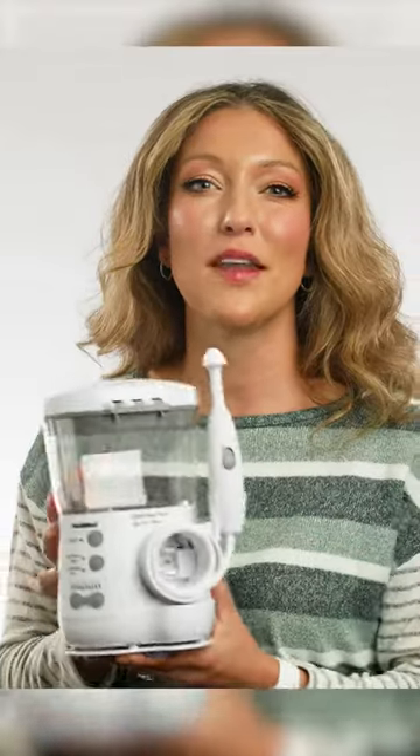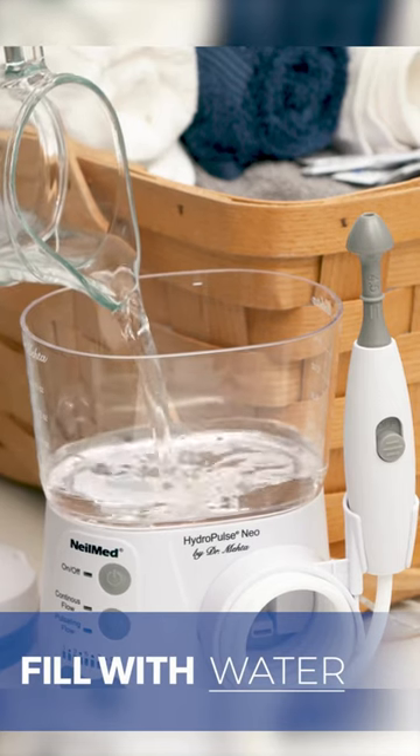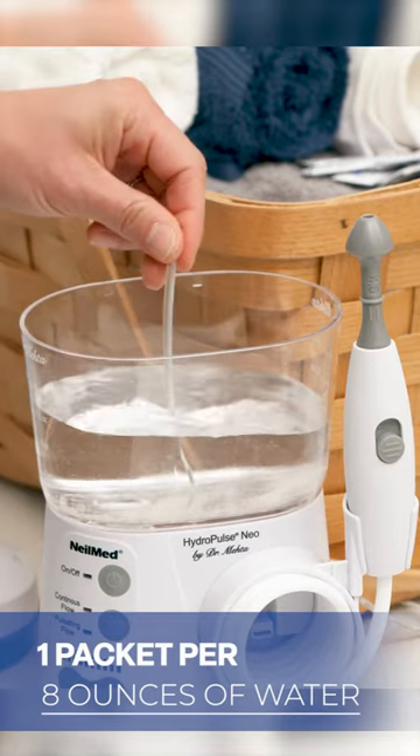To use the NealMed HydroPulse Neo, fill the water container with previously boiled, filtered, or bottled water. Stir one packet of NealMed sinus rinse into the water — it will dissolve immediately.